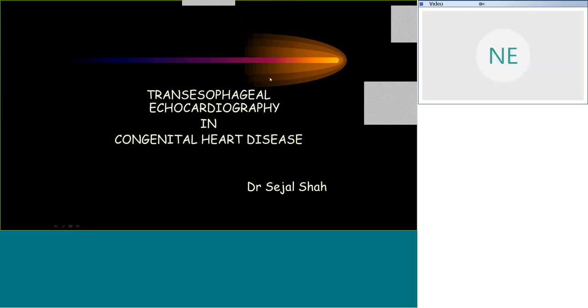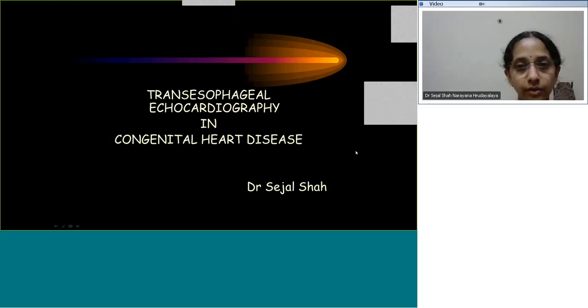Good morning, everybody. Today our topic is transesophageal echocardiography, the basic views. We'll be sticking to only the way we detect congenital heart disease and not adult.